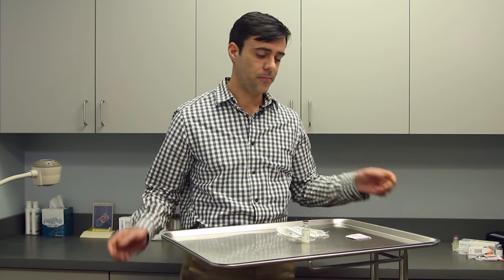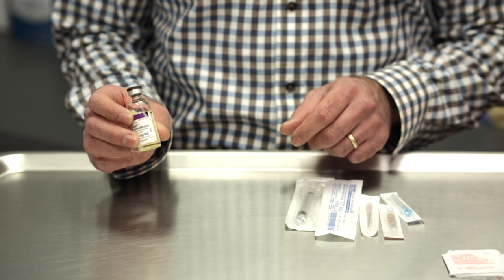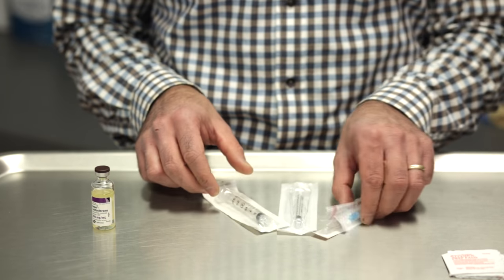In this video we're going to learn how to draw up a dosage of testosterone. Items that will be needed will be your bottle of testosterone, which you should have received from your local pharmacy, and syringes and needles.